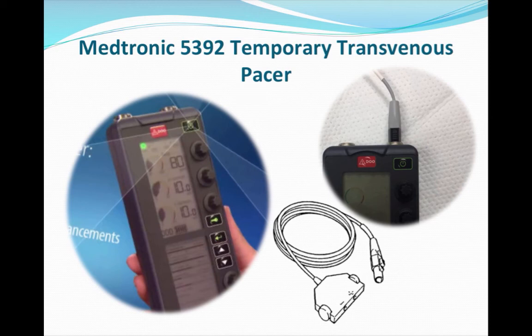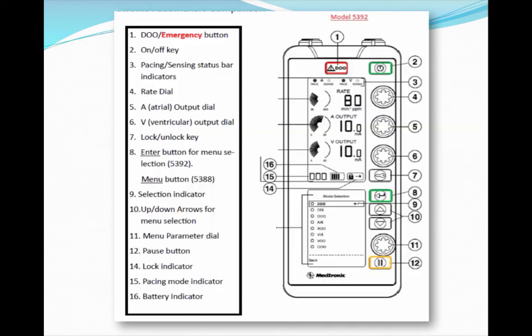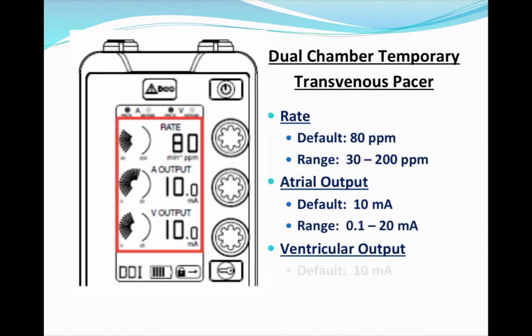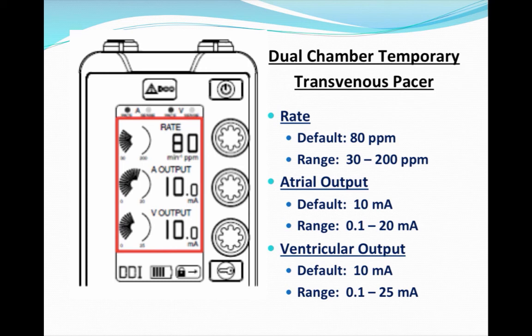Now we've got the pacing wire in and connected to the box. There are a lot more buttons on this one than we're used to. On the top, you've got the rate and both atrial and ventricular output knobs. The default rate is 80 paces per minute, and it can go as low as 30 or as high as 200 beats per minute. The atrial and ventricular output both default to 10, with ventricular output going up to 25 and atrial output up to 20.